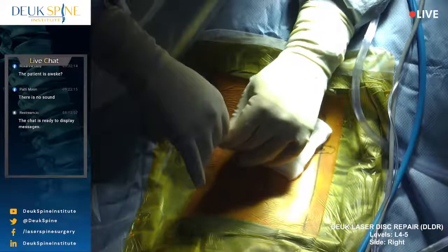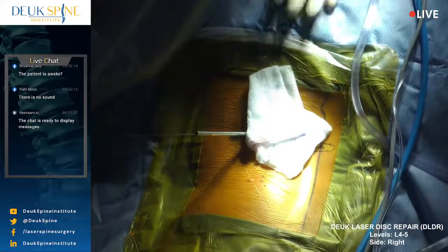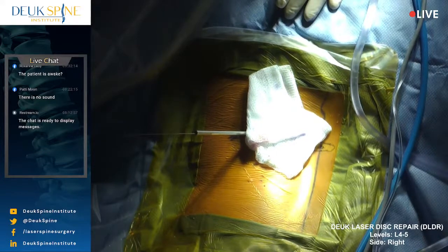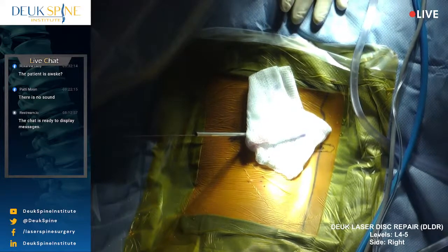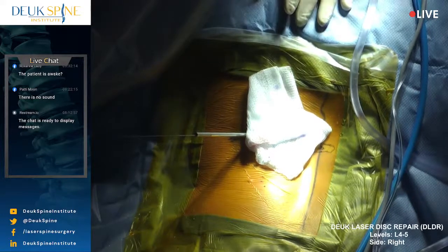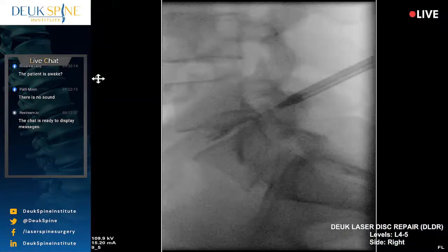So the balance in our patients is always between being comfortable and sleepy enough not to care, but not doing too much or too little so that they are moving around. So it's really challenging to get it just right, but that's why you need a good anesthesiologist, which we have. All right, I just waited a minute. Do you think I can proceed? Can we work on the 132?